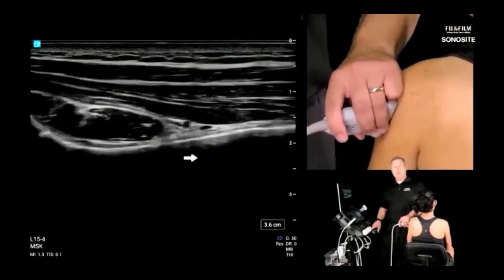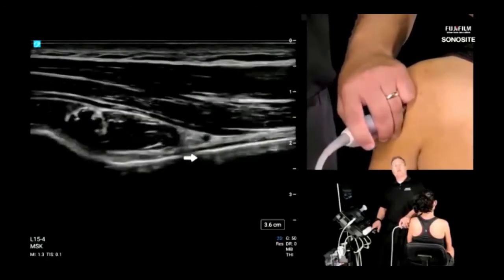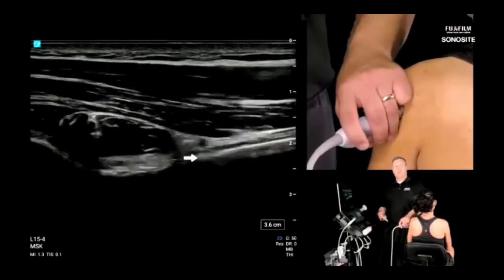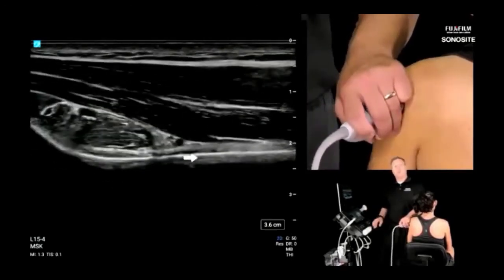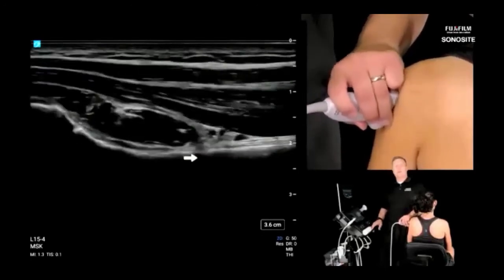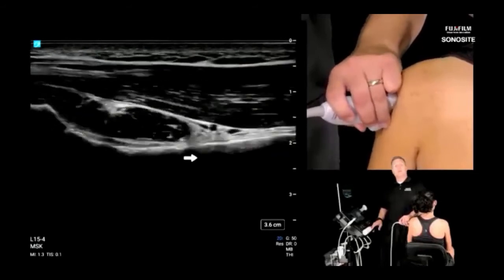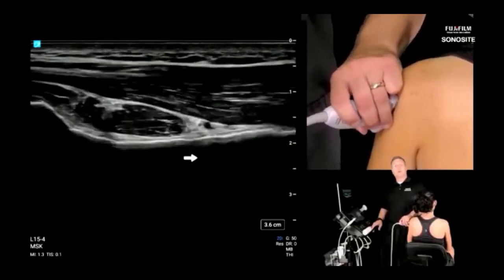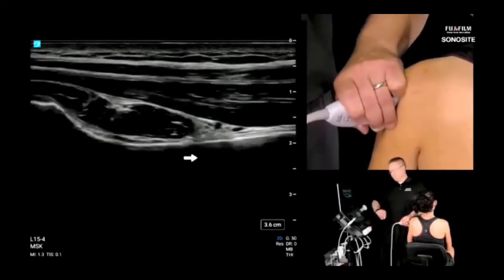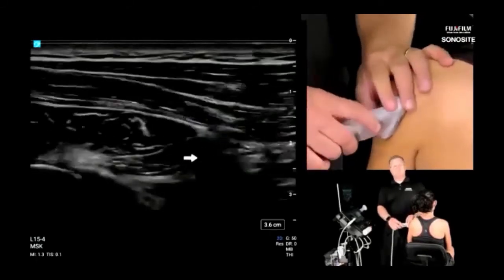maybe for a miscellaneous shoulder talk. If that's something that you would like, email Laura and we'll cover the random stuff like we're getting into now about latissimus, the quadrangular space, triceps, which is not a part of the shoulder protocol, but it makes great landmarks. Mm-hmm. Other pathologies like that can be evaluated in the shoulder. Yeah, definitely. Today, go ahead, Laura. I'm sorry, Daniel. Definitely email me if that's something you guys would like, because we can definitely put together a webinar that's just more of a Q&A for the miscellaneous areas of the shoulder.